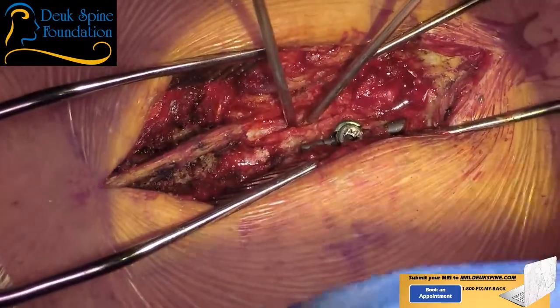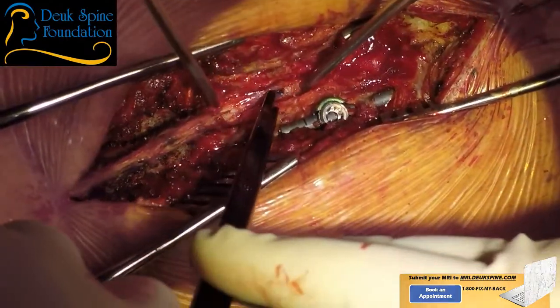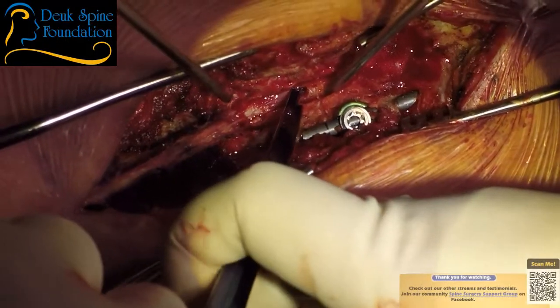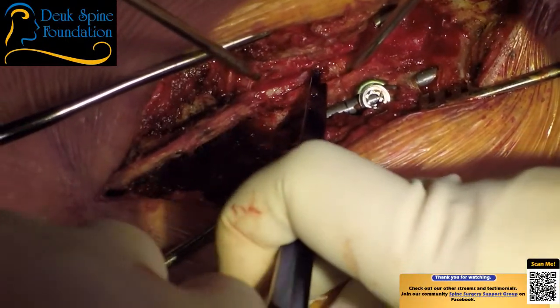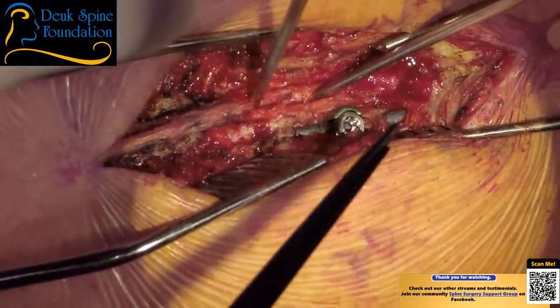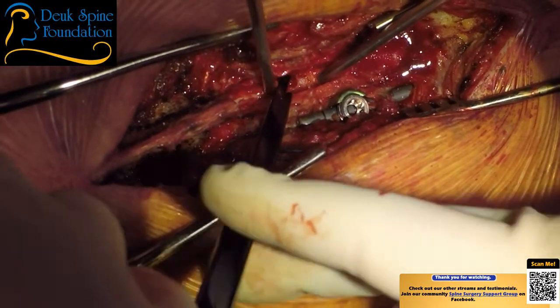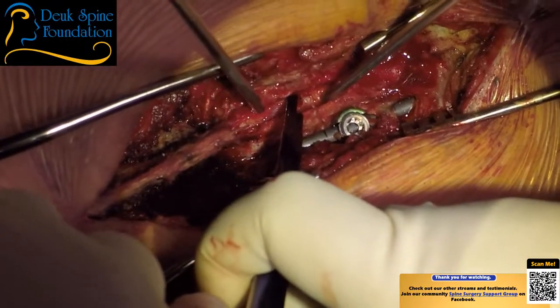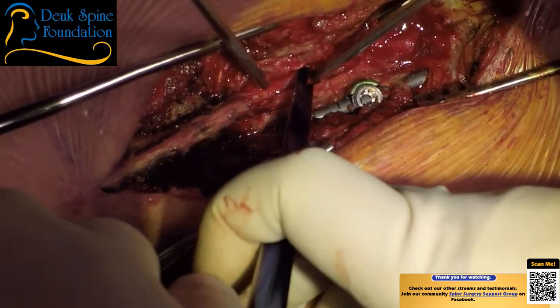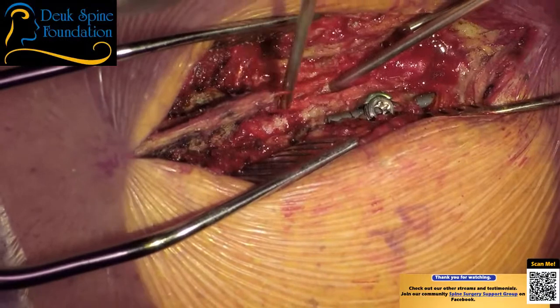Let me have a 2.0, 0.50 on the right. I mean on the left as well. So you're seeing an improvement? Yes, sir, I am. I can't get in there. Looks like a 20% improvement on the left and a 40% improvement on the right. 20% on the left, 40% improvement on the right. Yes, sir. That's fantastic. Now that's cortical response.